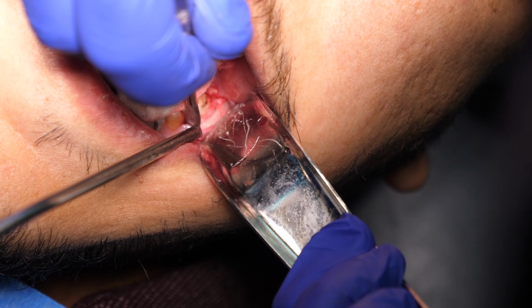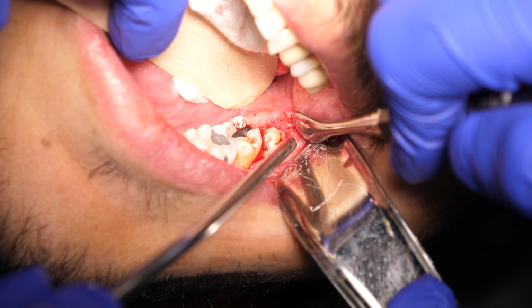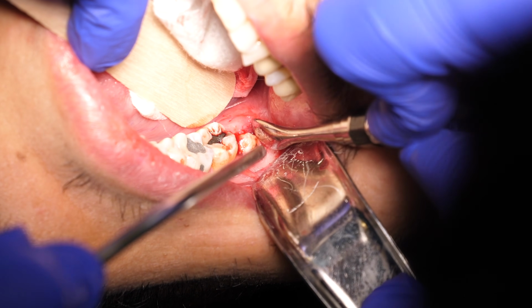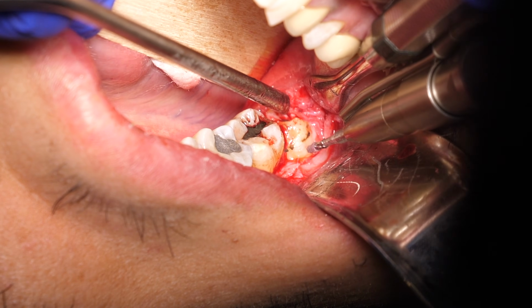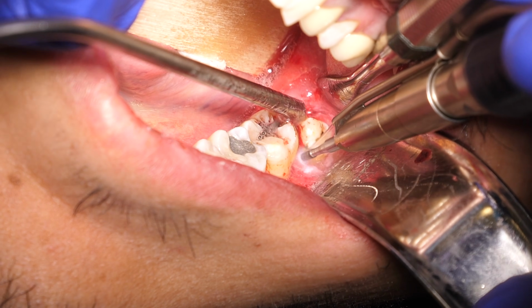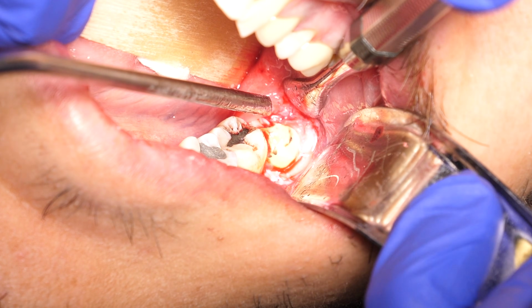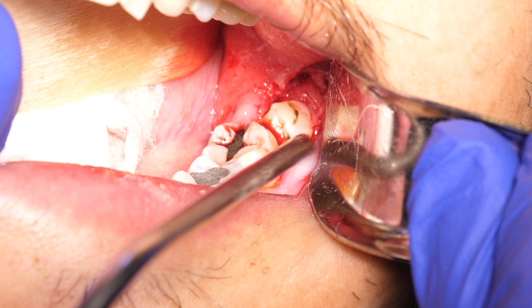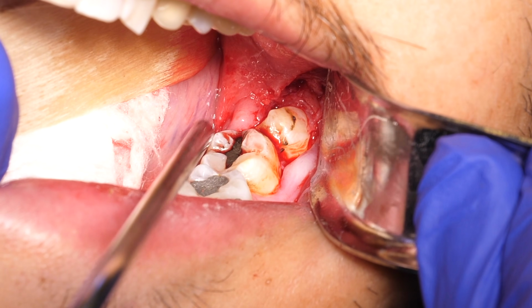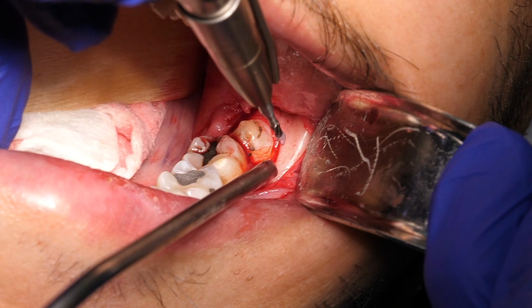Due to the history of the pericoronitis, the flap had scar and fibrotic tissue, which made the elevation of the flap cumbersome. Once the site is exposed, the clinical crown must also be exposed using either a number 8 round surgical bur, 702-703 fissure bur, and a surgical drill. Depending on the type of impaction, the specific approach may vary. In this case, the clinical crown is visible, so we proceed with troughing the buccal aspect of the ramus.